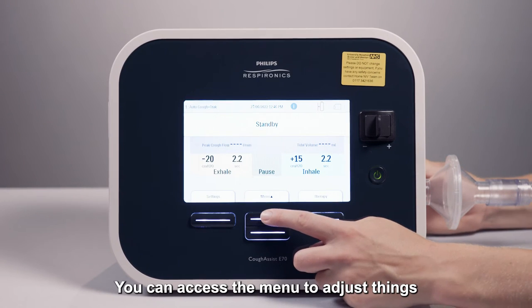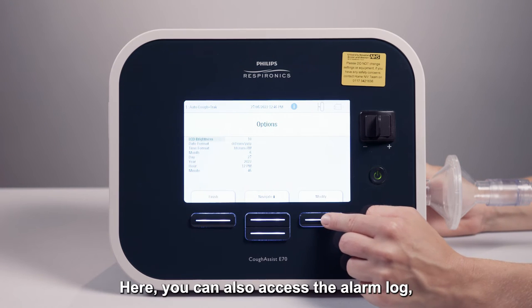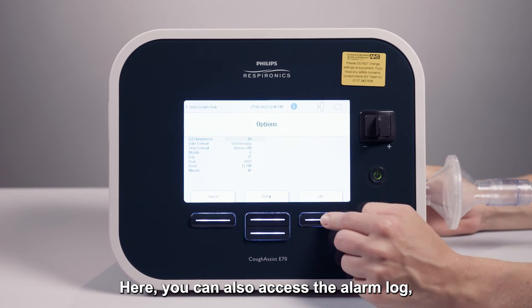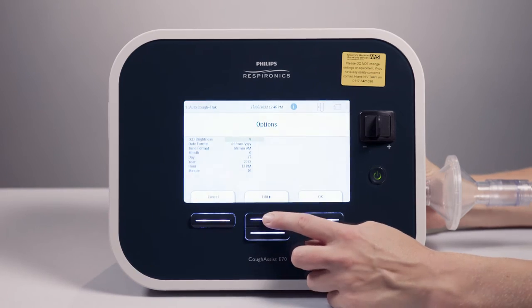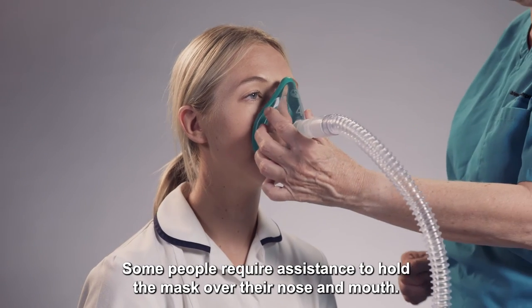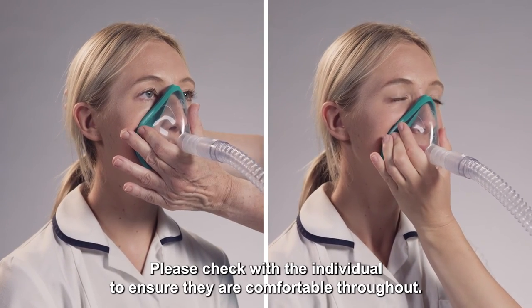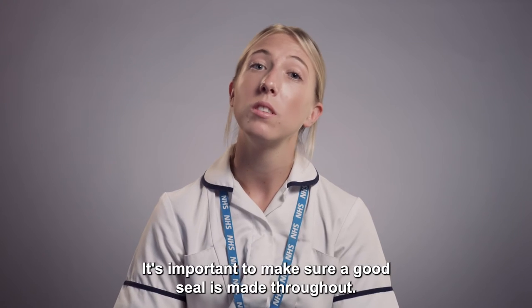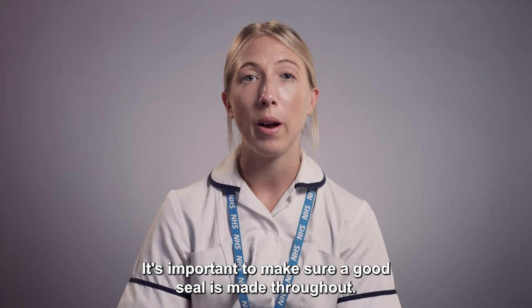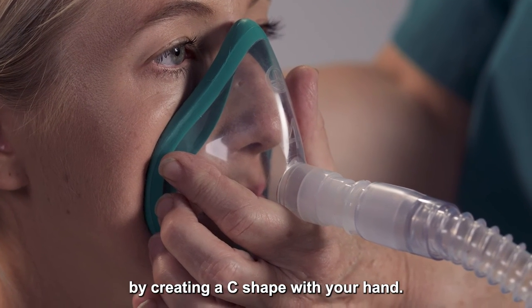You can access the menu to adjust things like screen brightness and alarm volume. Here you can also access the alarm log which helps the home NIV team solve any issues with the device. Some people require assistance to hold the mask over their nose and mouth, while others may be able to do it themselves. Please check with the individual to ensure they are comfortable throughout. It's important to make sure a good seal is made, which can be done by creating a C shape with your hand.